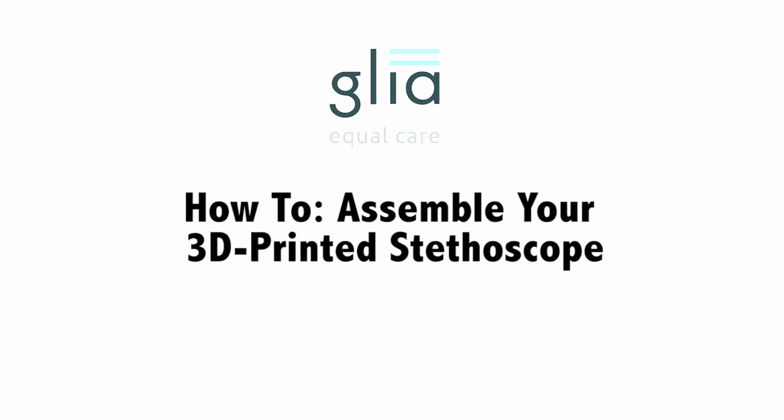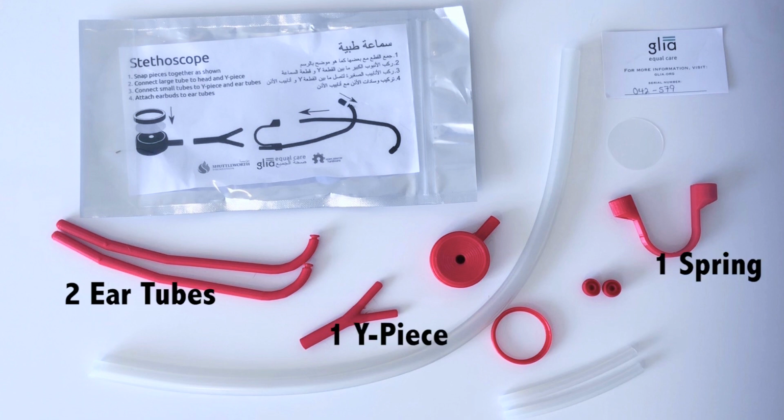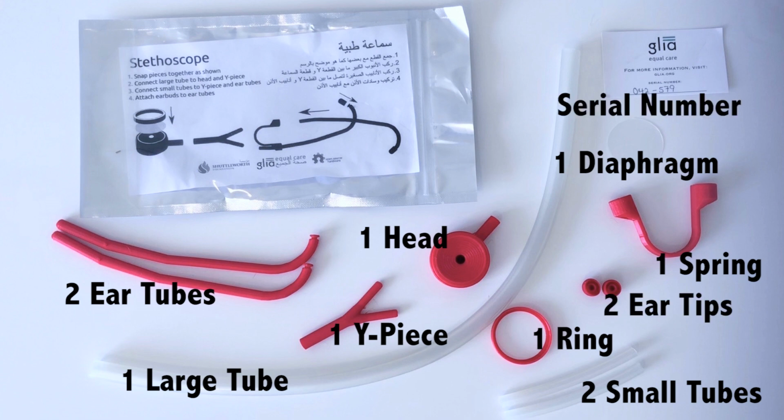In this video, we will demonstrate how to assemble your new 3D printed stethoscope. First, we will review the parts of the stethoscope included in the package. You should have 2 ear tubes, 1 spring, 1 Y piece, 1 stethoscope head, 1 ring, 1 large tube, 2 small tubes, 1 diaphragm, 2 ear tips, and a card with your stethoscope serial number.